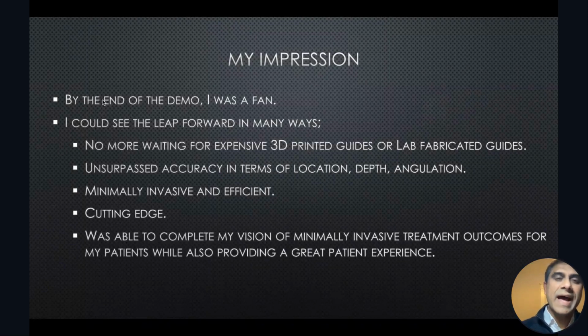And one time I printed the guide, and I was placing 4 implants on the lower arch. Only 3 little shells got printed, and the fourth shell never got printed. So guess what? I'm placing 3 implants using a static guide, and I was trying to place the fourth implant free-handed. I was like, oh my gosh, this is just not working for me.